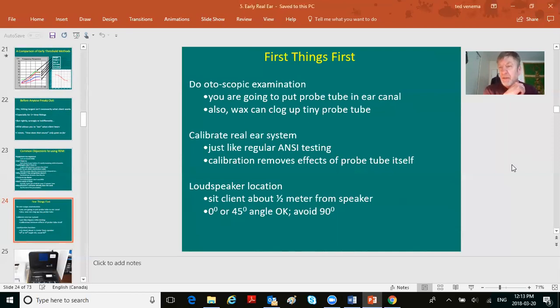Best not to be cheap, best to avoid. Just throw away the tube, put in a new one. Yes, it costs money, but it's the best. It's like using insert headphone sponges. You don't wash those either. You never wash those. You can't wash sponge.